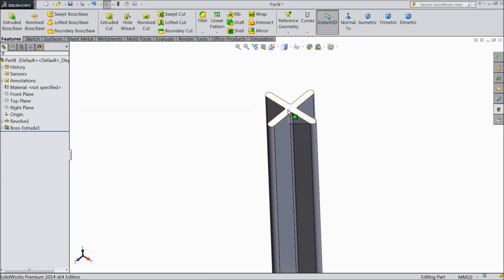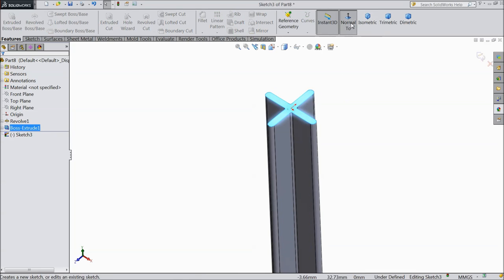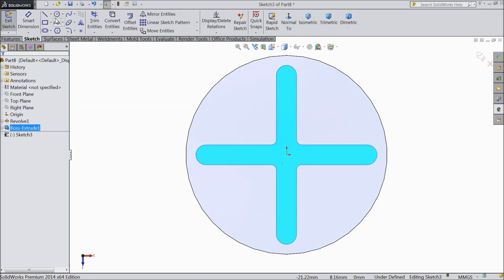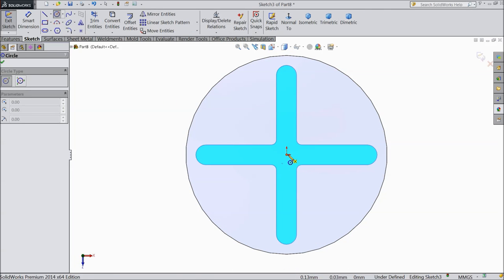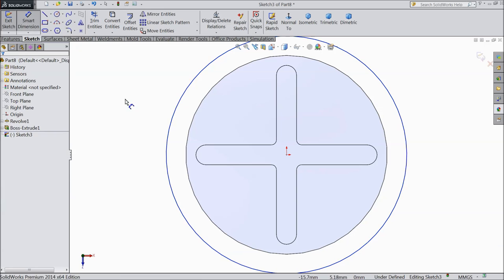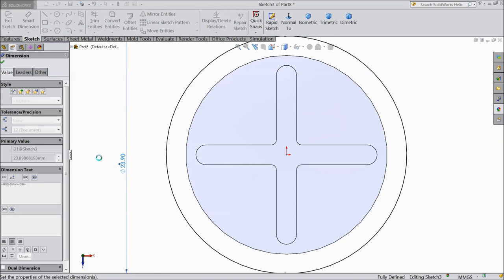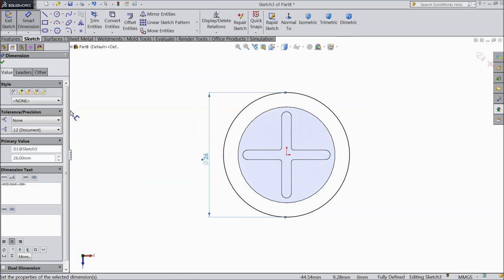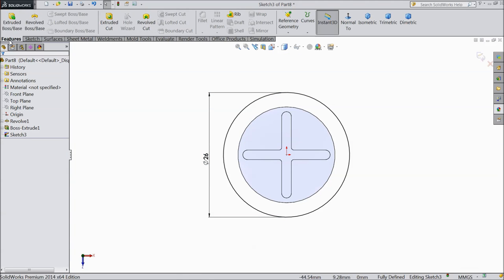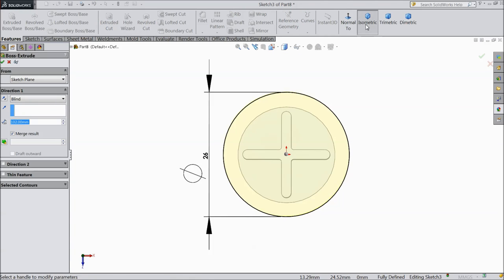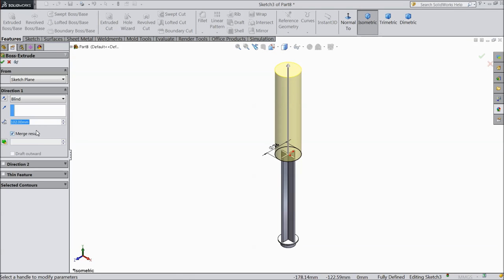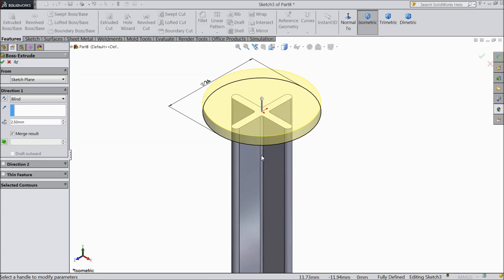Now select this face, sketch, normal. Here we will draw a circle and keep the diameter 26mm. Now select extrude boss and make the height only 2.5mm thickness.